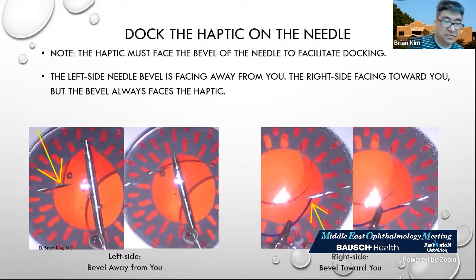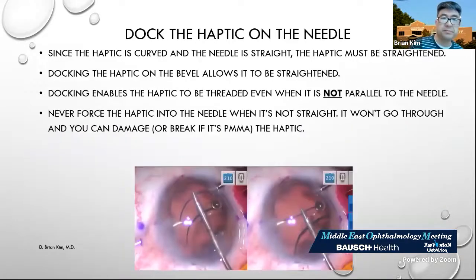So you can see again on the left side, the bevel is away from you, and on the right side, the bevel is towards you. But you can see the approach of the haptic is almost perpendicular, but as you're able to flatten it, it engages the bevel and it docks, and you're able to turn the haptic, flatten it out, make it parallel to the needle, and then you can slide it.